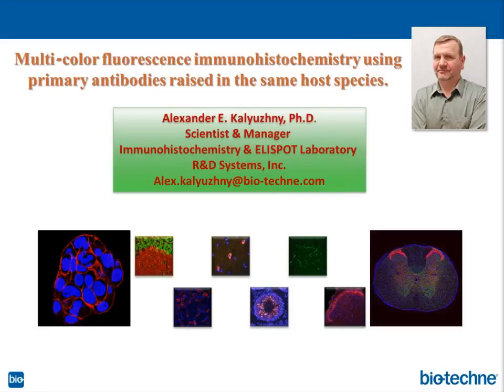And usually for quantification, we look at around 10 tissue sections, and then average the signals and put the results into a table. That's what we do. So one section is not enough. Two sections are better than one, but still may not be quite good. And some people say the magic number is three, not less than 3 sections. Well, probably, but we prefer to go with a high number of sections, so we feel more confident that our quantification is accurate enough.